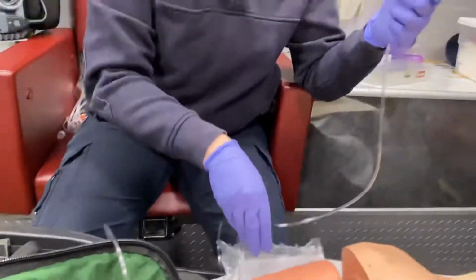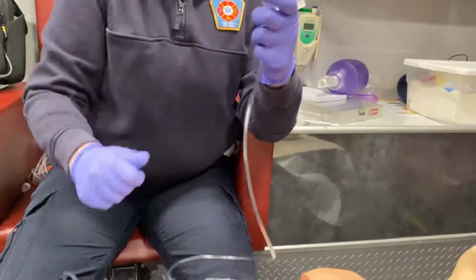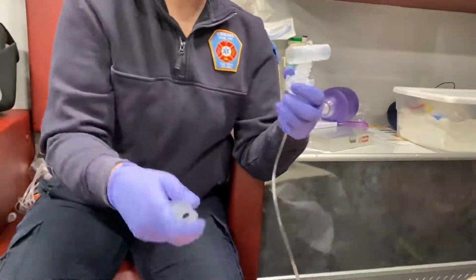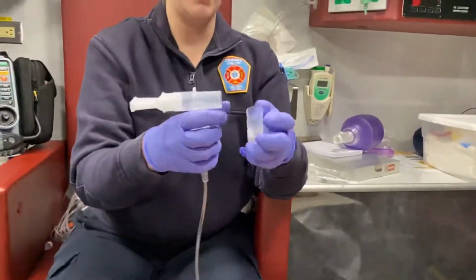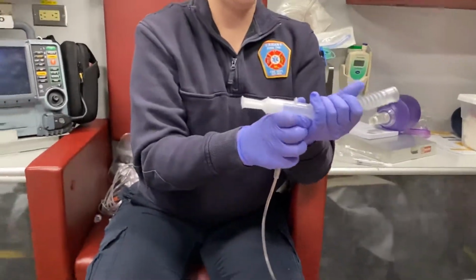You have three more pieces. Your T piece is going to go on top. And then you have the mouthpiece that fits in the larger side. And then you have your extender piece that we want to extend out. It's going to go on the smaller side.